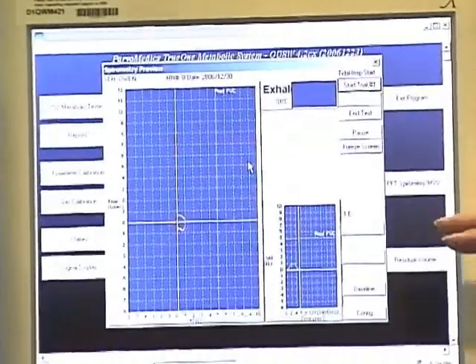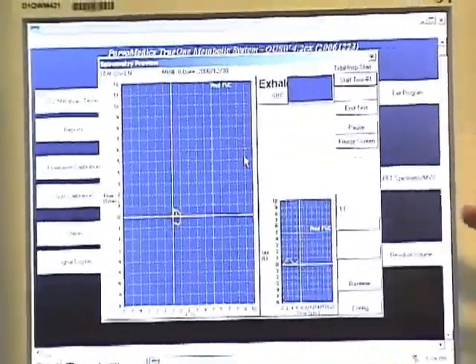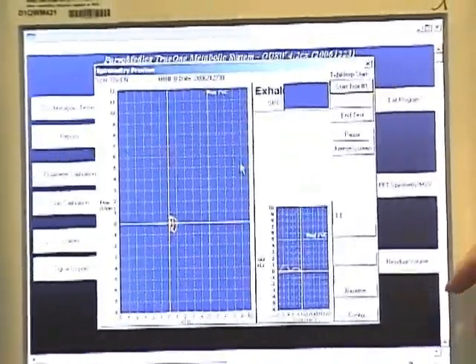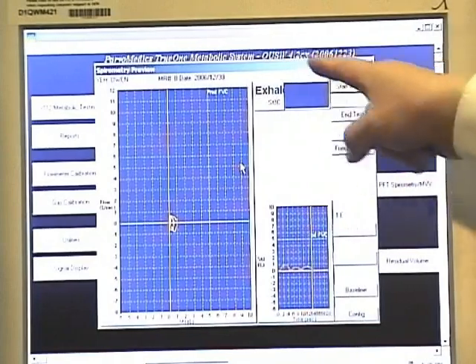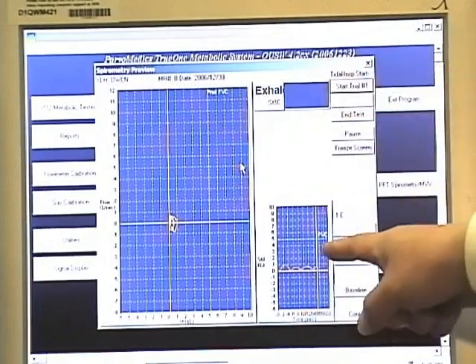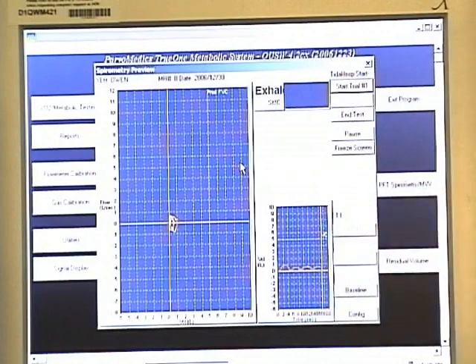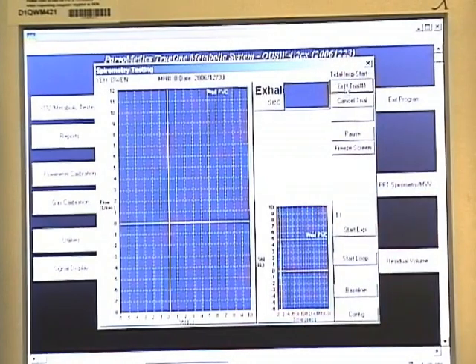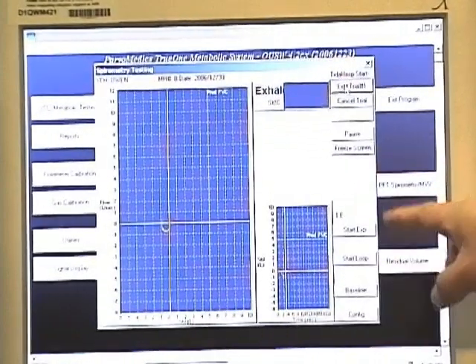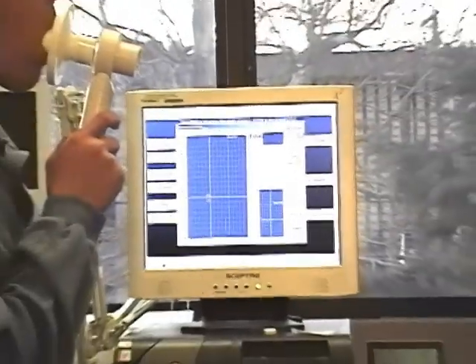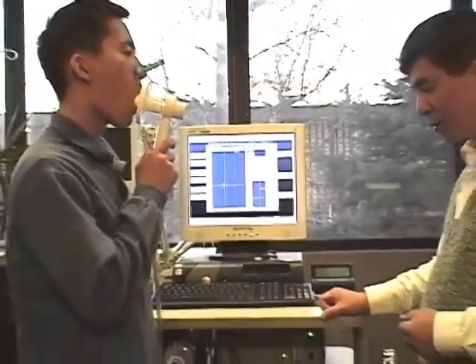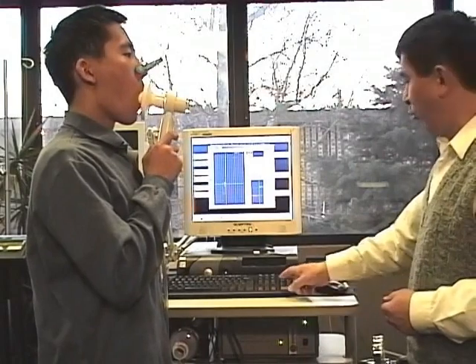The spirometry has three trials, unlike exercise testing. Each trial has three screens. The first screen is the preview, like what we have seen. After we see the breathing signals, we click Start Trial 1. Wait for a couple of breaths, then ask the subject to inhale big on the next breath — inhale big and hold.